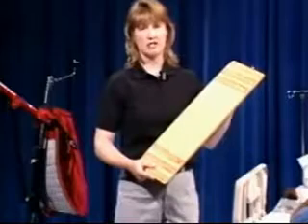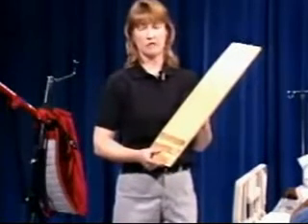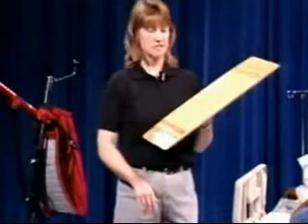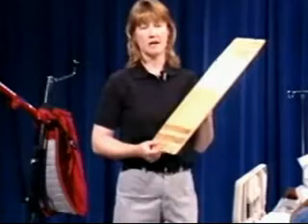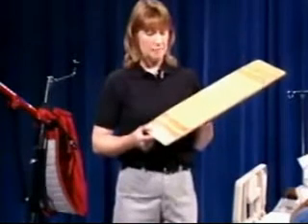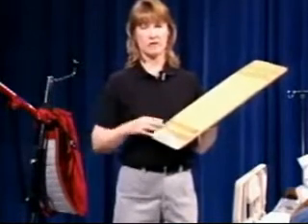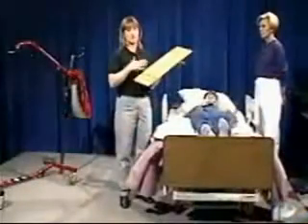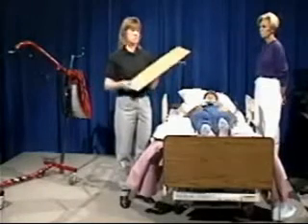It's not hard for the patient to use, but I do want to point out that this is used on a patient who would not be bearing weight for whatever reason, would not be putting weight through their legs, either because they're not able to because of an injury, or they just are too weak or too large to do that. These boards need to be used on patients who do have good upper body and upper trunk strength, because they need to be able to control their trunk for balance while they're moving. You won't be able to do that for them. They need to be able to do that while you assist them in sliding across.